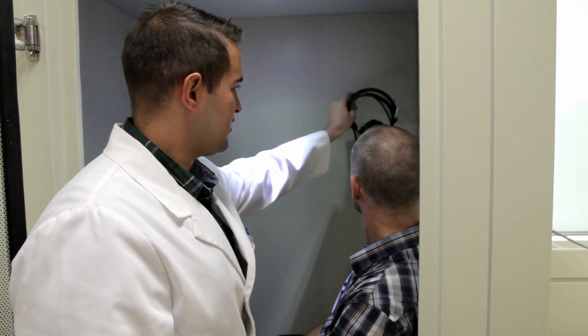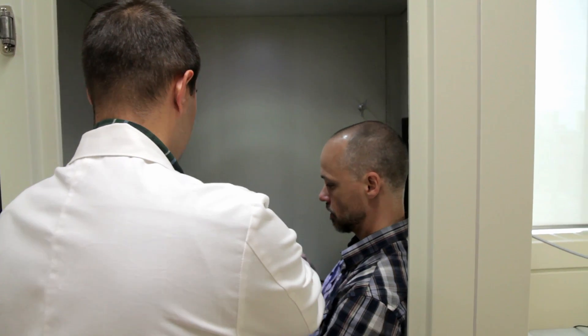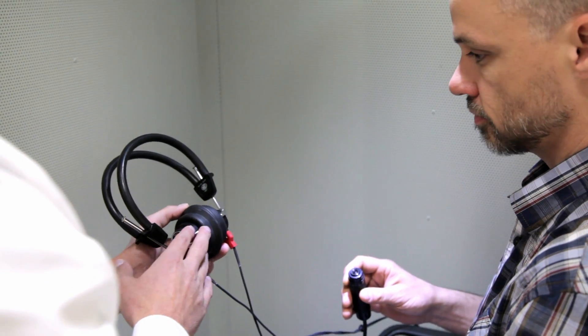Third, the individual will enter our sound booth where they are subjected to a series of different frequencies and tones. Finally, Intrinsic Analytics will analyze the resulting audiogram and provide recommendations.